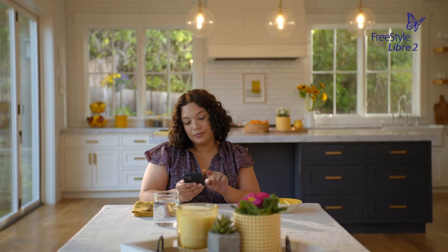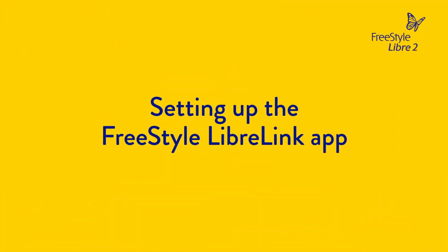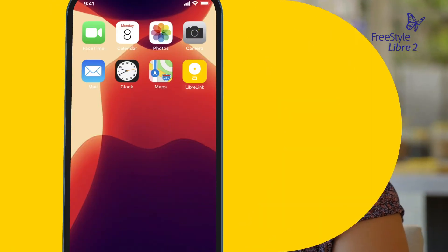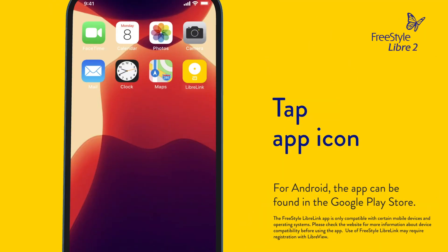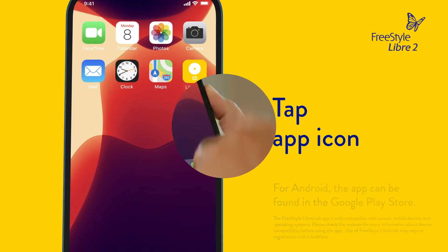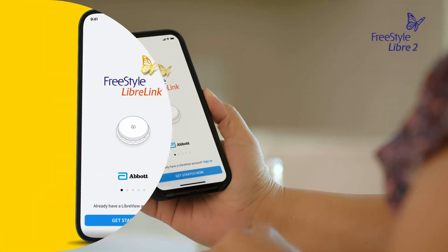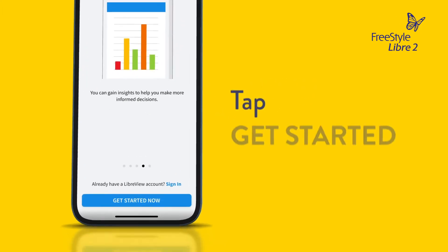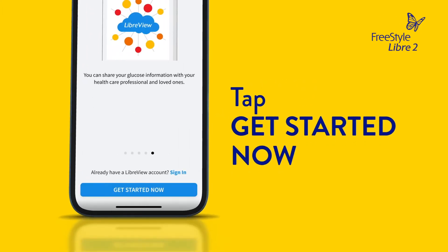Setting up the app is easy and only takes a few minutes. To get started, download the Freestyle LibreLink app from the App Store and tap the icon to open it. Swipe left to see some helpful tips, or tap 'Get Started Now' at any point.